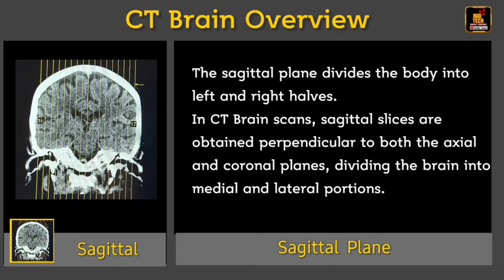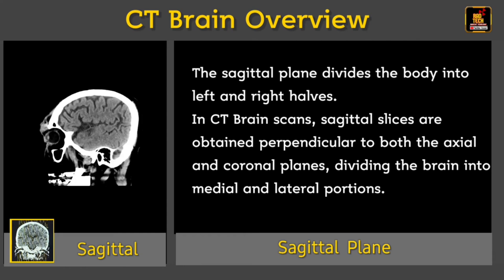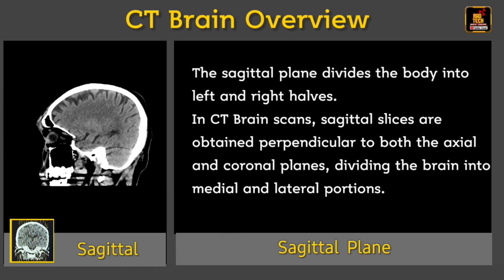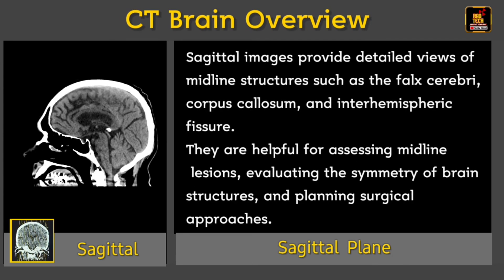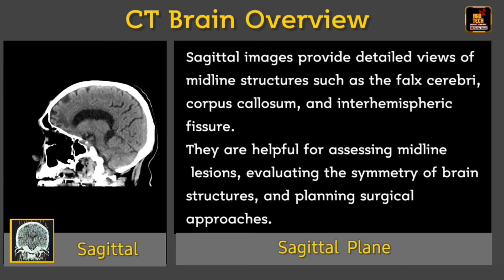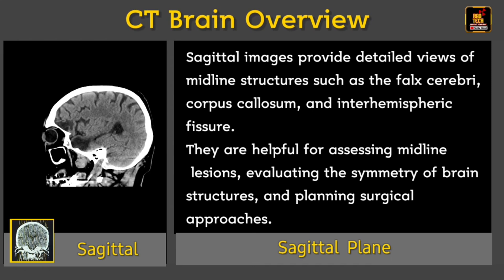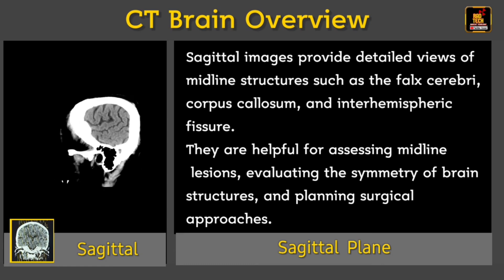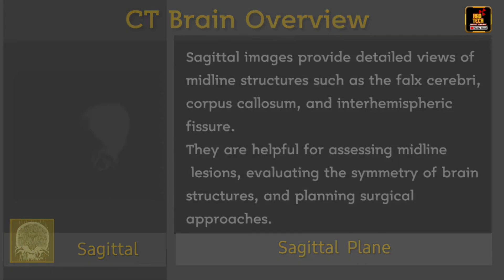The sagittal plane divides the body into left and right halves. In CT brain scans, sagittal slices are obtained perpendicular to both the axial and coronal planes, dividing the brain into medial and lateral portions. Sagittal images provide detailed views of midline structures such as the falx cerebri, corpus callosum, and interhemispheric fissure. They are helpful for assessing midline lesions, evaluating the symmetry of brain structures, and planning surgical approaches.